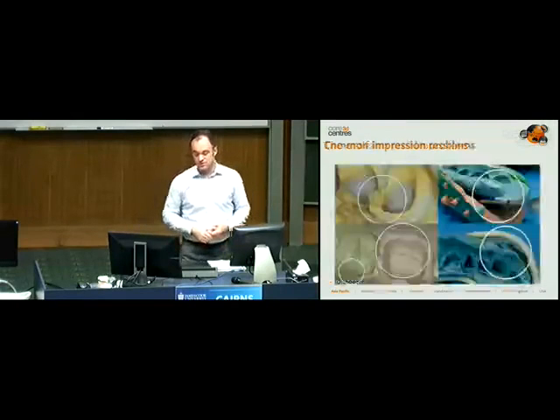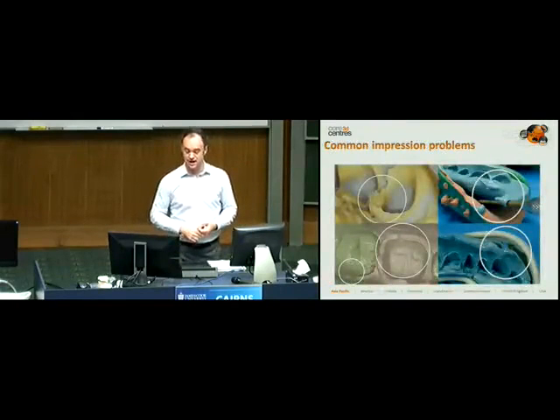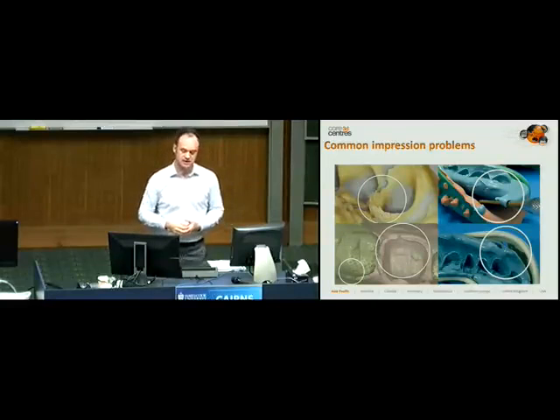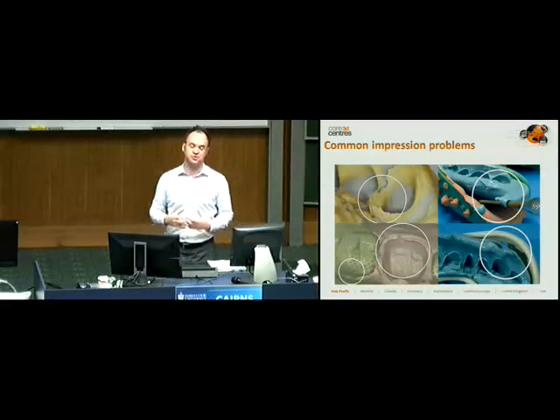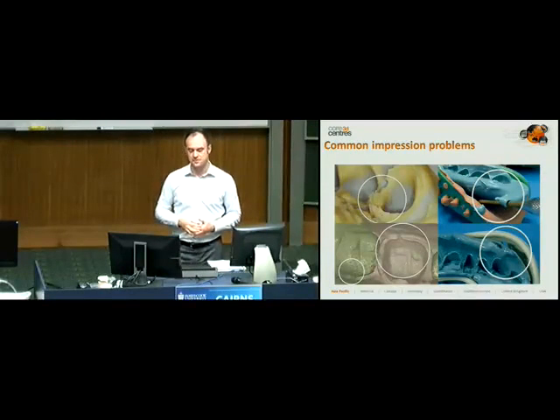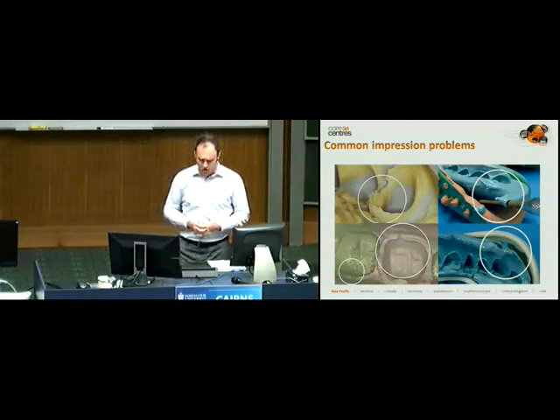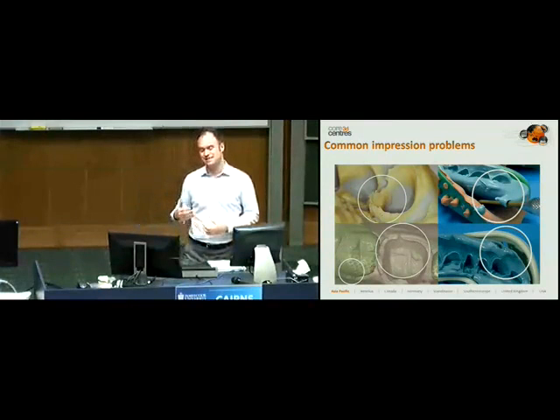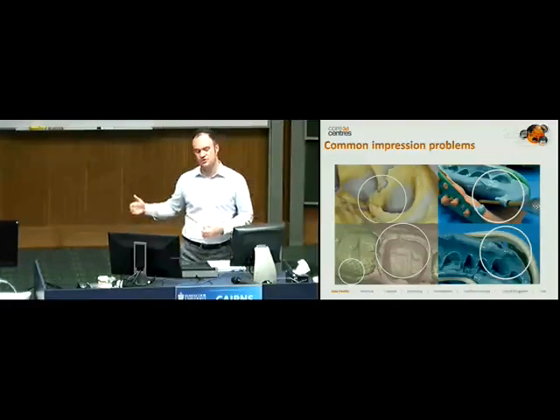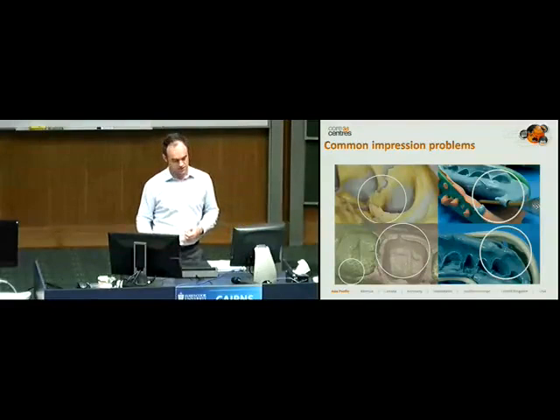Some of the problems that you see when you look into that tray, and interestingly, a lot of these problems can be overcome in the laboratory, but lab technicians spend an inordinate amount of time fixing these things and often giving you a compromised result without you realizing it. And labs have been doing this very skillfully for a very, very long time. So most of these problems are overcomeable and are every day. But what digital will do for you is bring consistency, and consistency is a word I'm going to be using throughout this short talk.